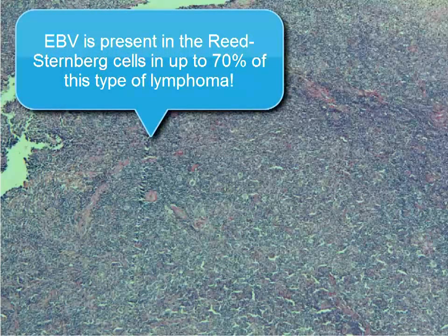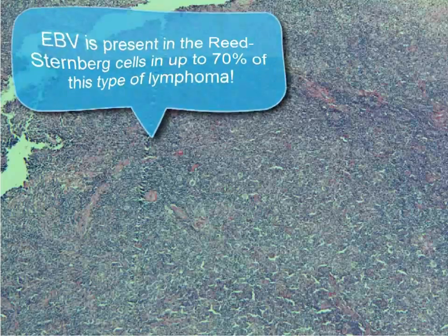This is a case of classical Hodgkin lymphoma, and this is a low-power view of the lymph node that's involved. One interesting thing about Hodgkin lymphoma compared to other lymphomas is that it tends to spread in a systematic fashion from node to node, starting in one node and then moving along the lymph node chain, infecting other lymph nodes. That might have something to do with EBV, which is really commonly found in the Reed-Sternberg cells in this type of Hodgkin lymphoma.